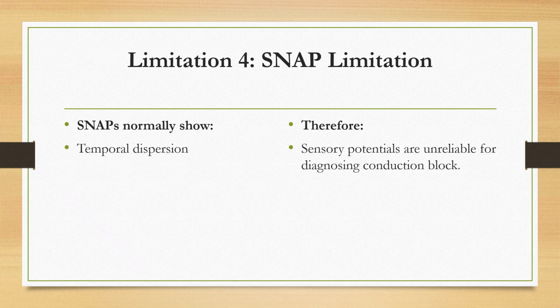Limitation 4, SNAP limitation. SNAP normally shows temporal dispersion. Therefore, sensory potentials are unreliable when diagnosing conduction block.